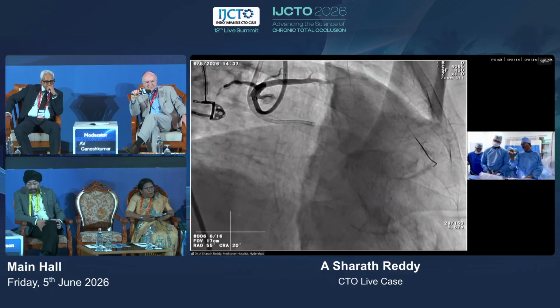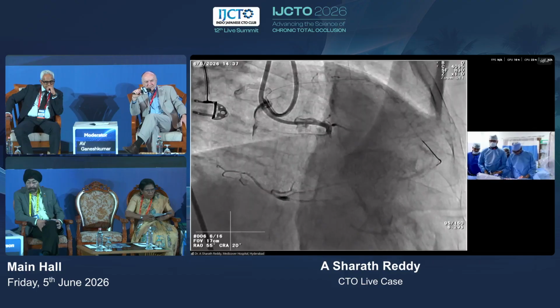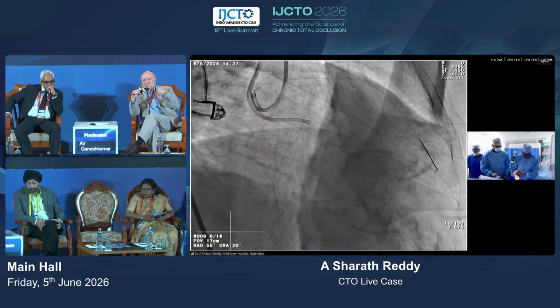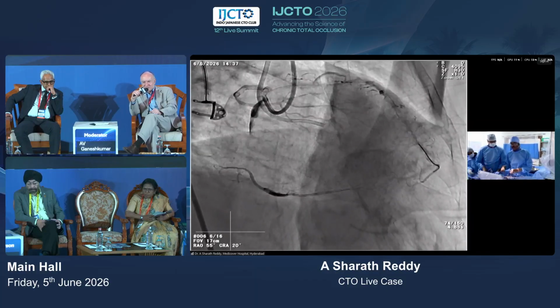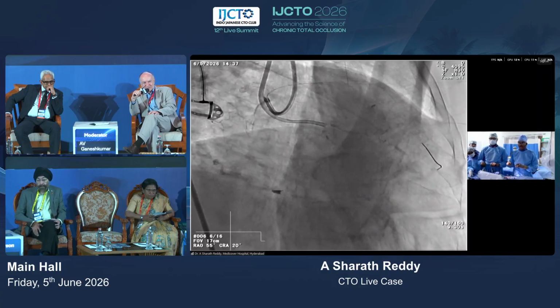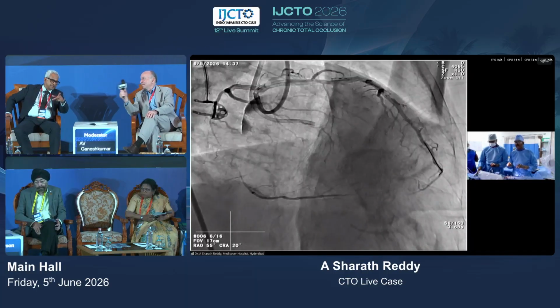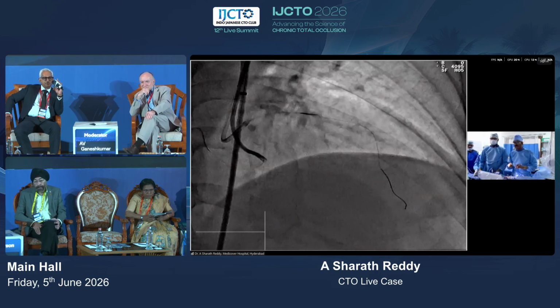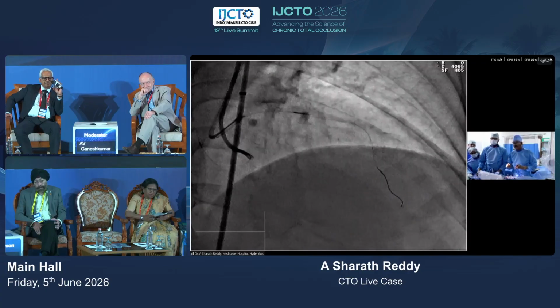The second one is based on the CT we decided. And importantly, what you show here is that simultaneous injection doesn't mean simultaneous injection, but waiting until the filling of the distal retrograde comes and then antegrade. In the first picture of dual injection, you injected the antegrade first and then the retrograde. So can you show it again, Sharath? The first dual injection?